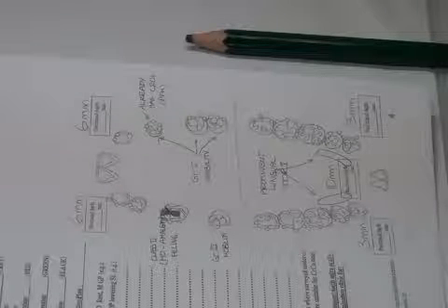I could place rests, yes I can. I could place my guide plane, yes I can. Plate, sorry. Guide plate, I could do that. So grade 2, that's the border area. I cannot clasp it. I cannot rest it. But I can put guide plates on it. Okay? This is grade 2.